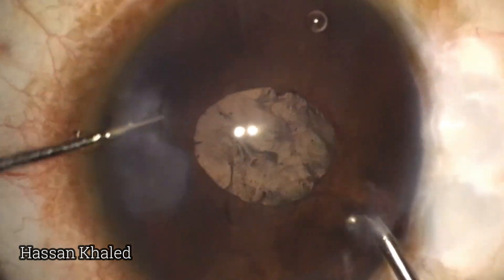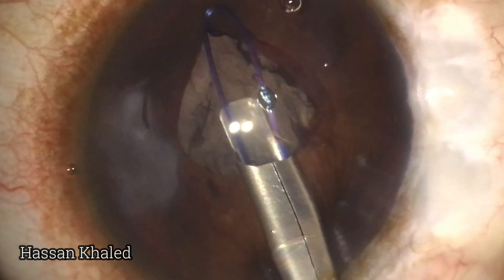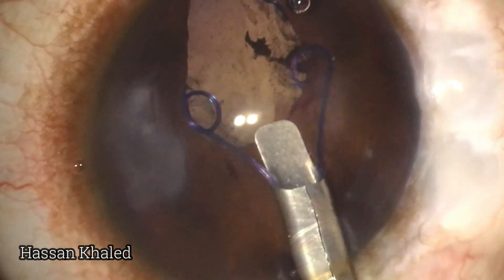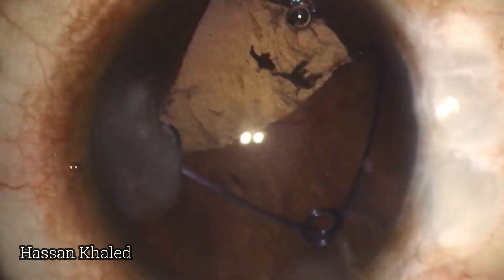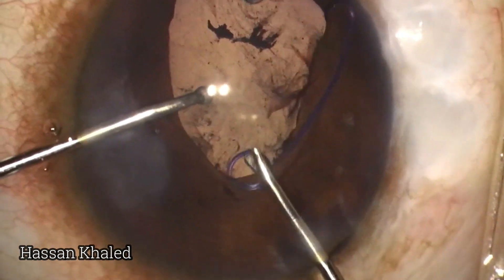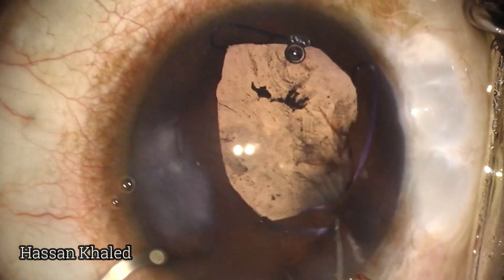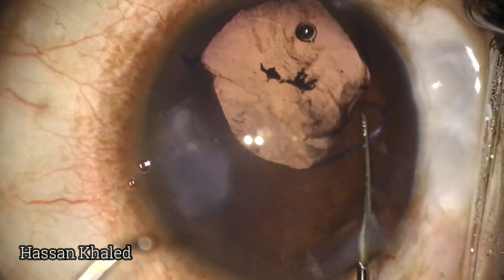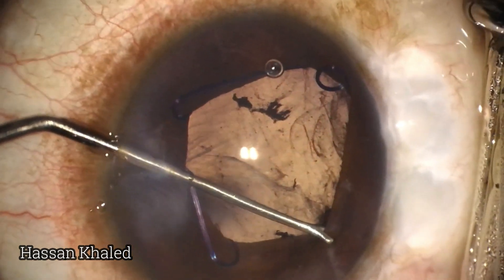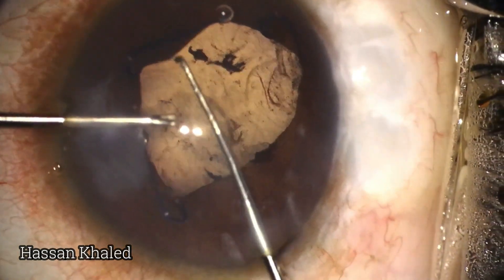Now the pupil is around three millimeters in diameter. Here is the Malygin expander ring — the distal part and the lateral part were fixed properly. However, while fixing the proximal part, the lateral part disappeared behind the iris. That is why I rotate the Malygin expander ring, trying to extract the hidden islet into the anterior chamber to refix it again.